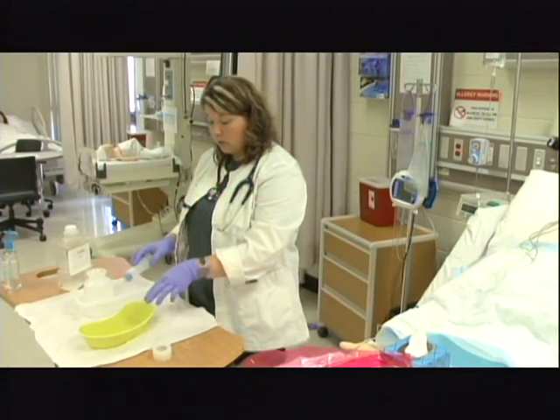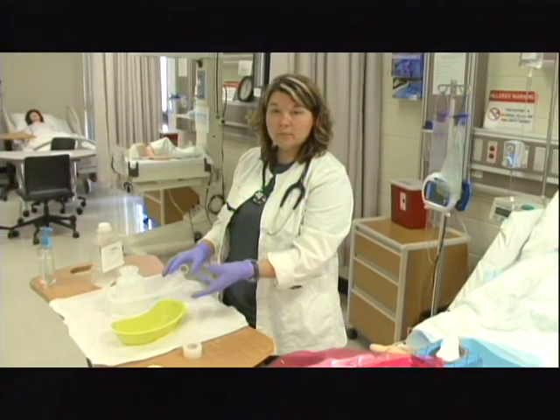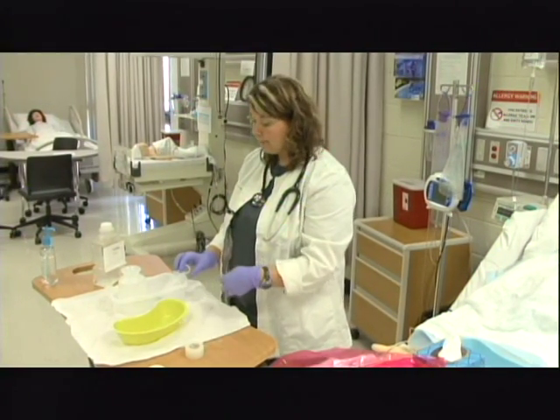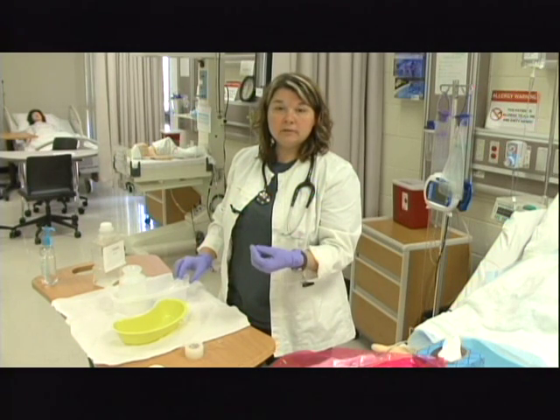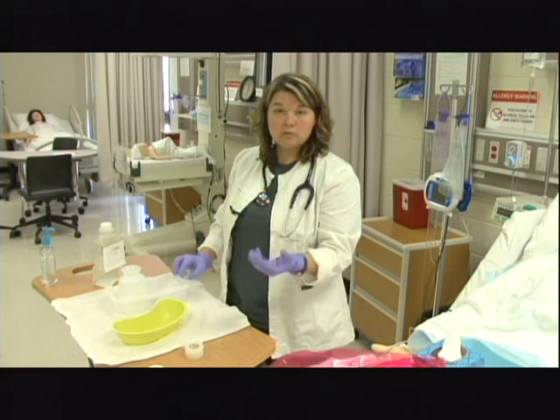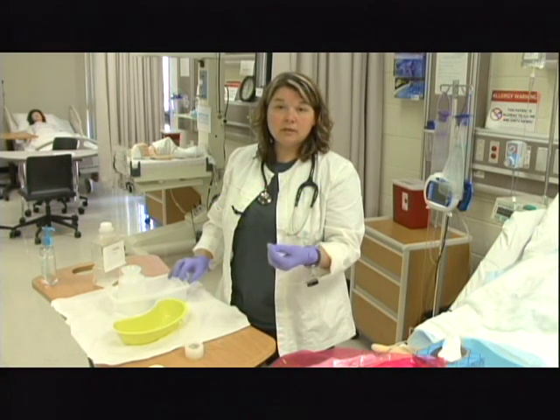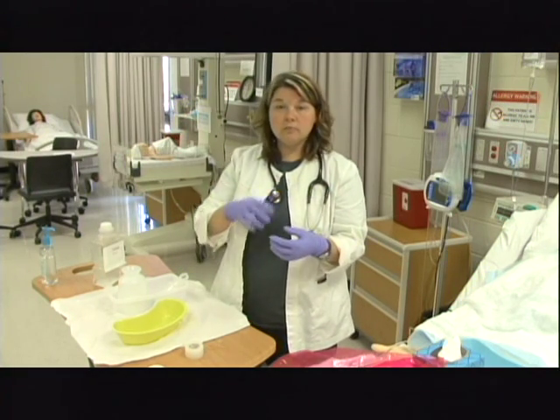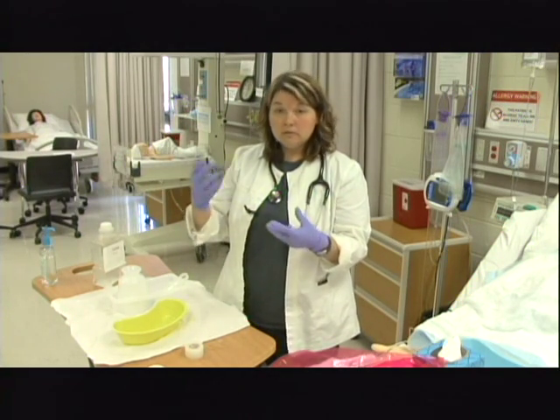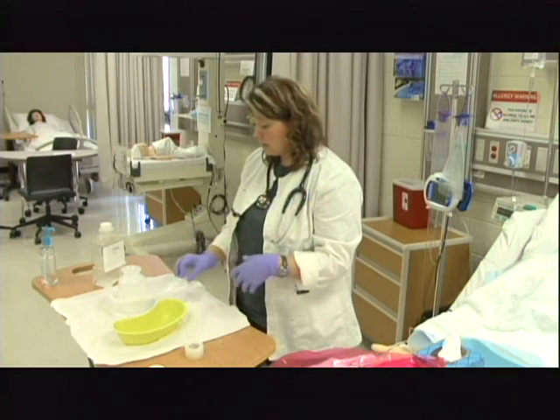And I need to confirm, and your textbook says that your gastric pH should be 5.5 or less. Most of them are going to be around 0 to 4. Now, depending on your facility policy, they may have you clear this with normal saline or sterile water or tap water, or they may have you clear it with air. I prefer to clear the tube with air because that way, whenever you're pulling the tube out, there's no risk of leakage of the saline or whatever coming back out of the tube and getting into the patient's lungs.